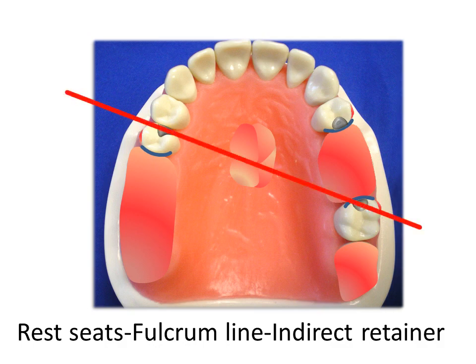Once the fulcrum is located, we can identify the location of the indirect retainer. Here we see that the bicuspid rest is ideally situated to function as the indirect retainer.